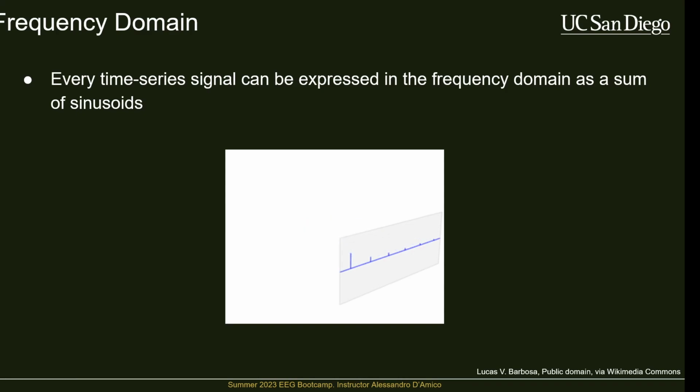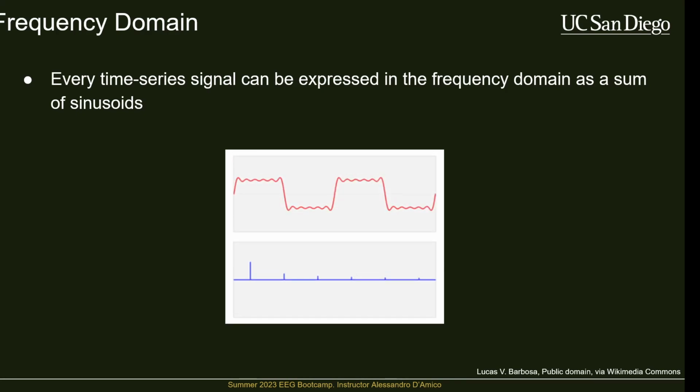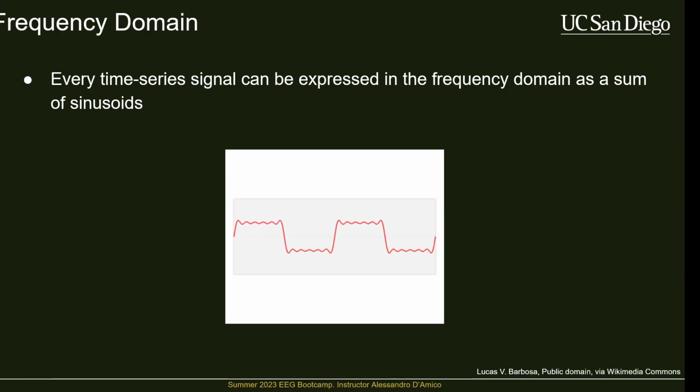I'm pretty sure. But essentially, you can take any pattern of squiggly lines that you draw, and say those are all points moving in time. There's a way to represent any signal, no matter how complex, as a sum of different powers of perfect sinusoid or cosine waves.